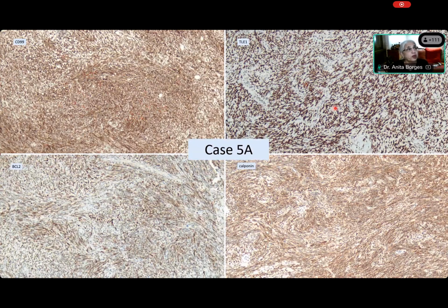This is TLE1. What has it marked, Elsa? Not positive, diffuse. Yes, what has it marked? It's not just to say that it is positive. In which compartment of the cell is TLE1? Ma'am, nuclear positive. It is nucleus. Yeah, you see the spindling of the nuclei. It's a beautiful nuclear positivity.